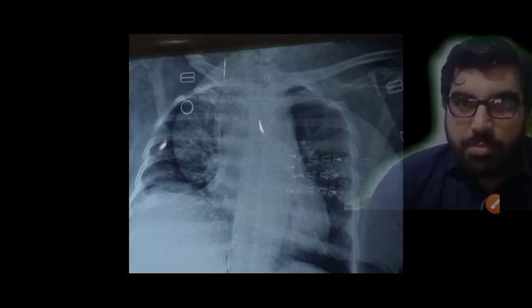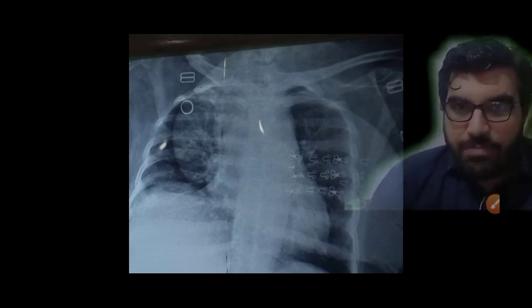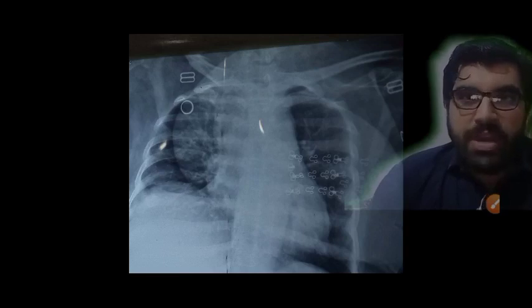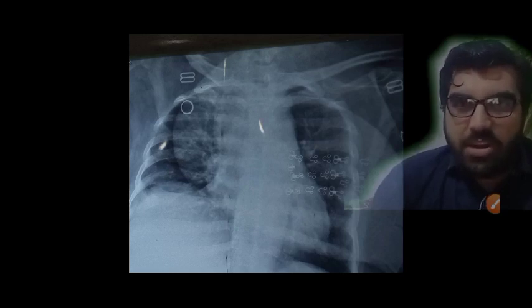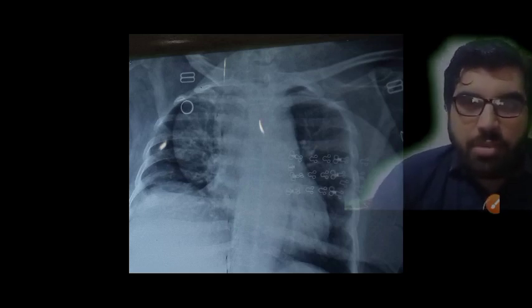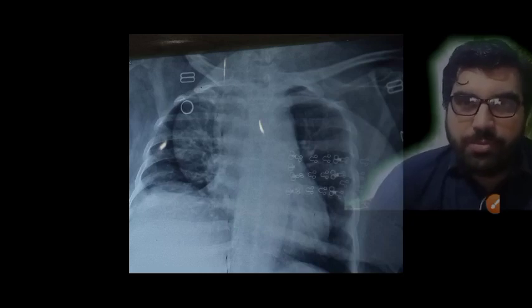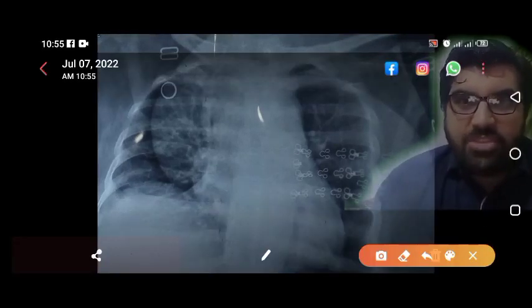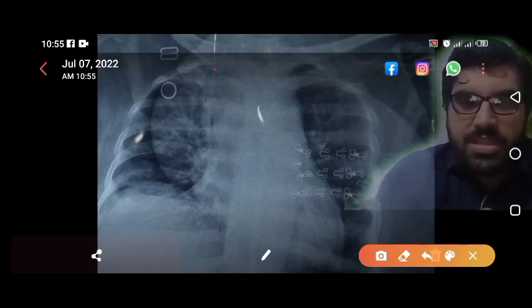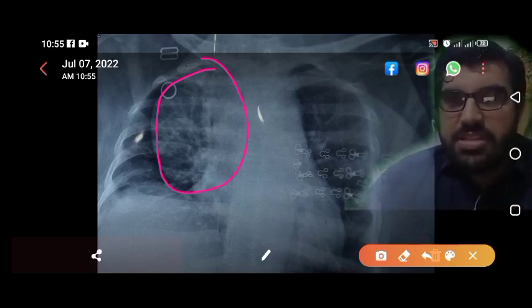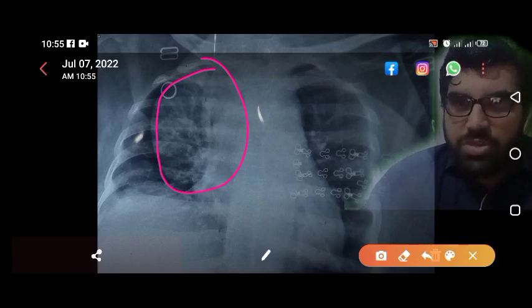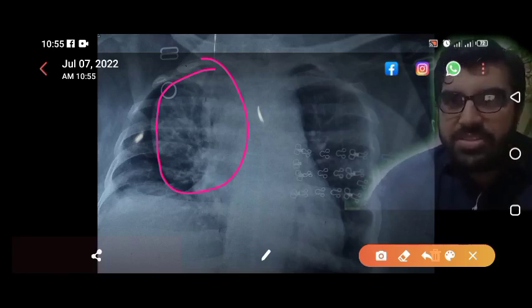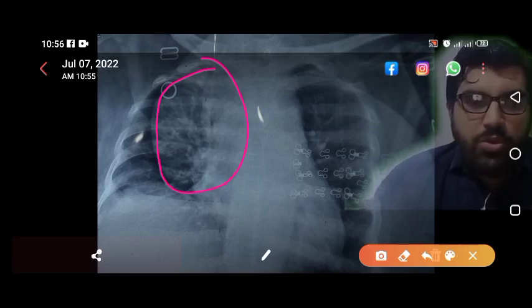Today we are going to discuss another very important case. This patient presented with a chief complaint of shortness of breath and is an already diagnosed case of rheumatoid arthritis for the last 10 years, on methotrexate for the same duration. If you focus on this X-ray, the first thing that comes to mind is this finding — and this was the reason the patient was referred for a CT scan, labeled as a huge mediastinal mass.